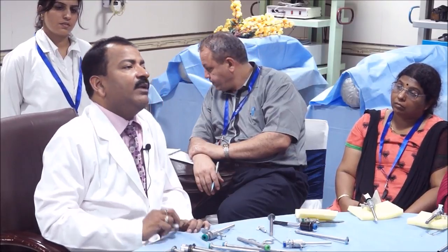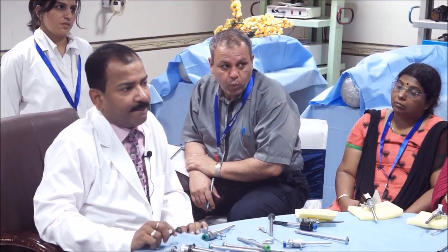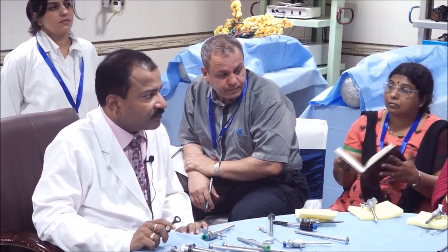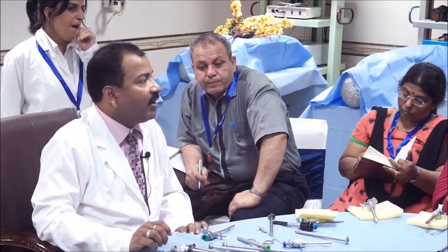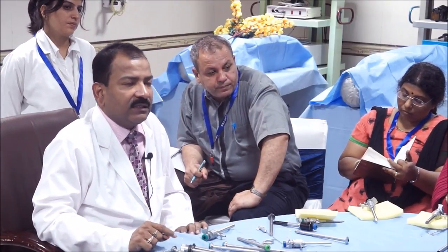Now the question is, how many 10 mm and how many 5 mm? At least one would be 10 mm. The answer is at least 1 should be 10 mm. Why? He is saying 2 10 mm. For tissue retrieval, yes. For tissue, yes, you are also correct.